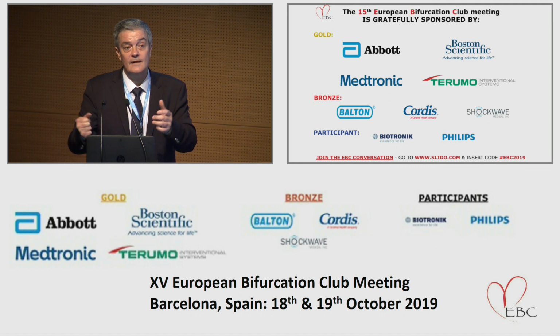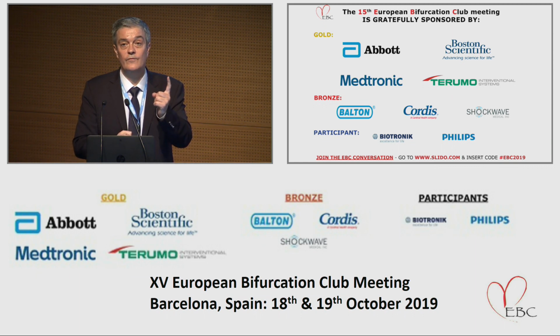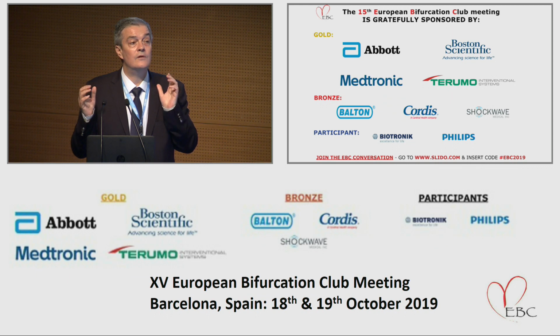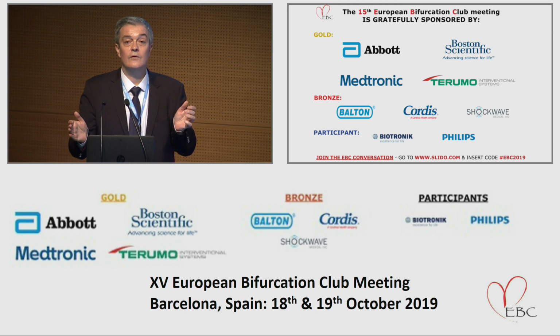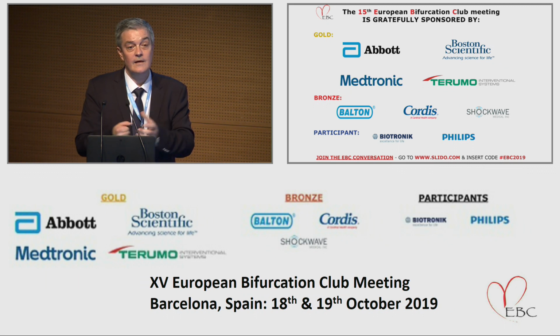And this is really necessary, because if you see the data, it's really unbelievable that in 2018 only one third of bifurcation stenting was finished with POT. So in two thirds of procedures, you don't even do POT. You go crossover stent and have coffee with your team outside the lab. So I think these images are convincing enough that we have to proceed and at least perform POT.